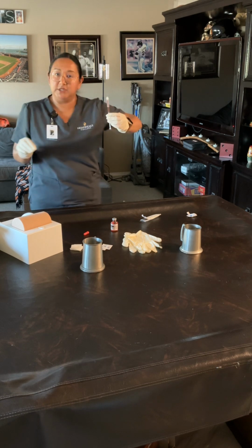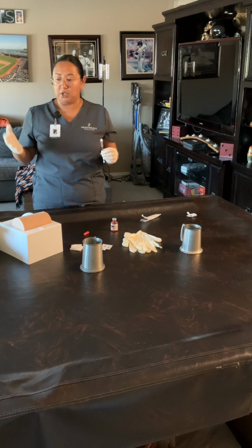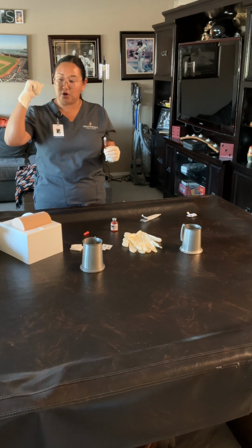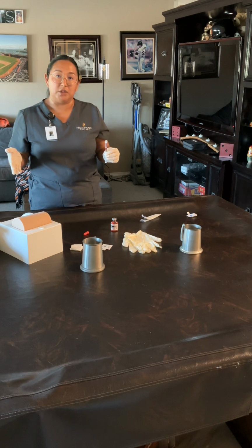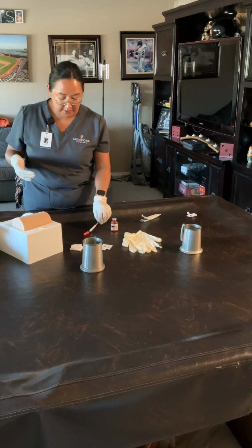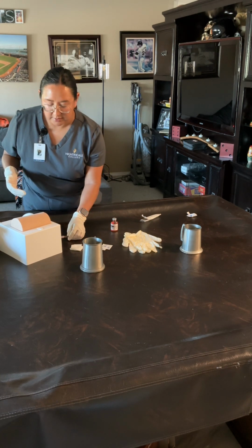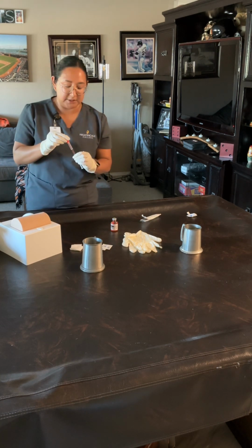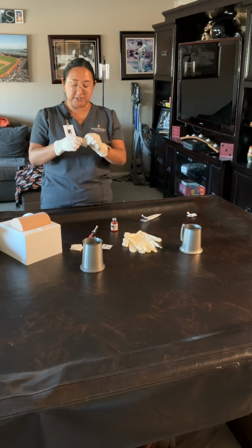Usually for subcutaneous injections, you will use the lower abdomen, the back of your arm, or the upper thigh. And in this case, we're going to do the lower abdomen. And I will scoop the cap here and close it because I need to prepare the injection site.